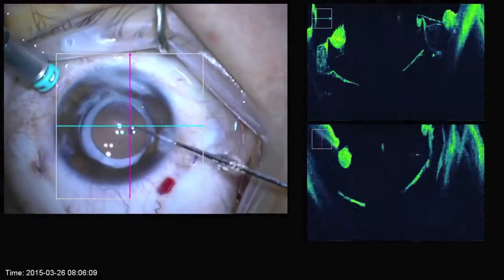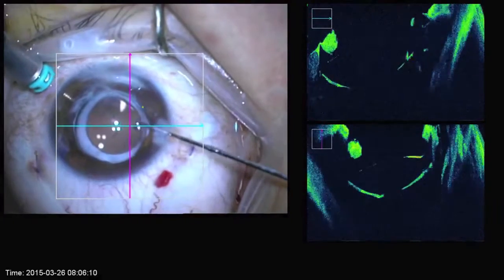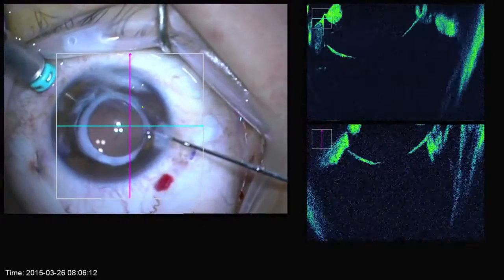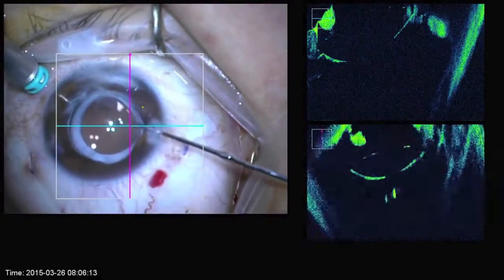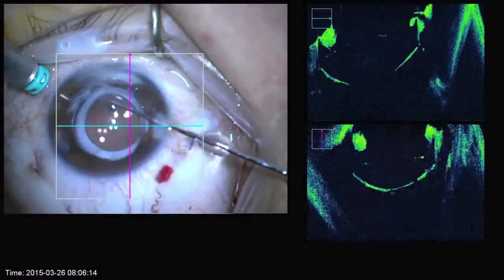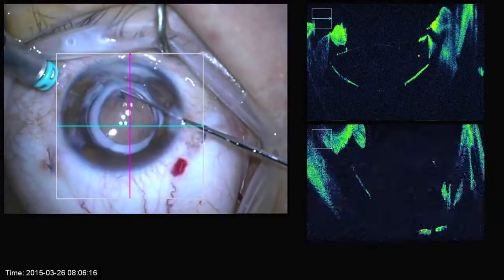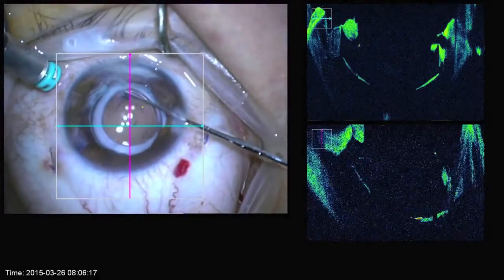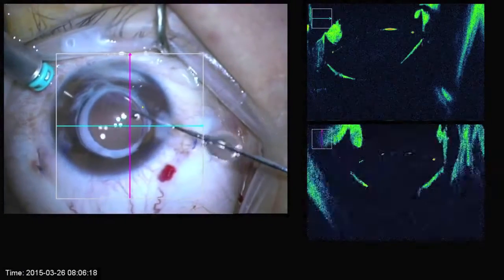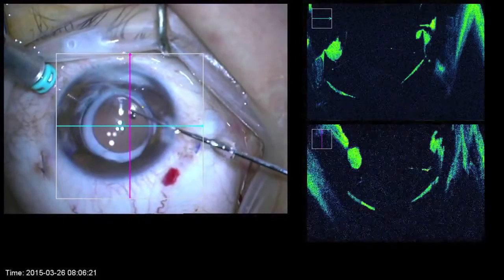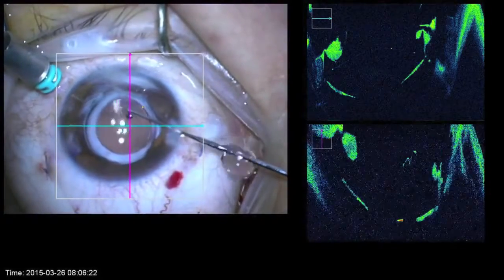As you can see the IOL is tilted. As I depress on the inferior edge of the IOL you can see in the inferior OCT scan that the lens tilt goes away temporarily, but promptly returns once I release with the Kuglen hook.